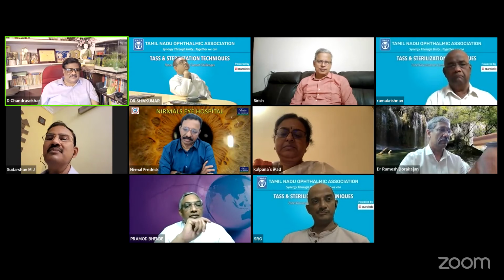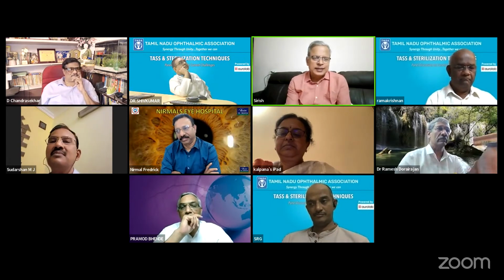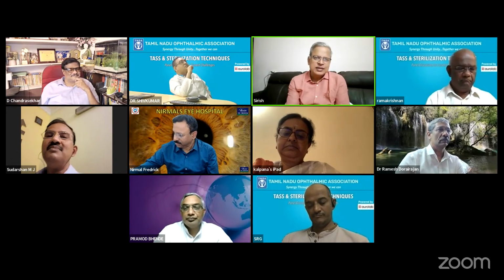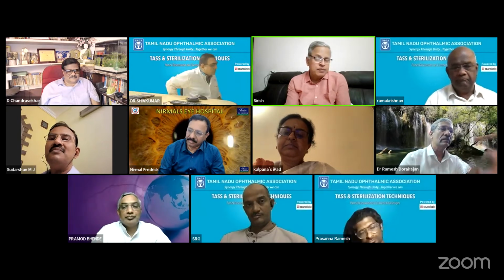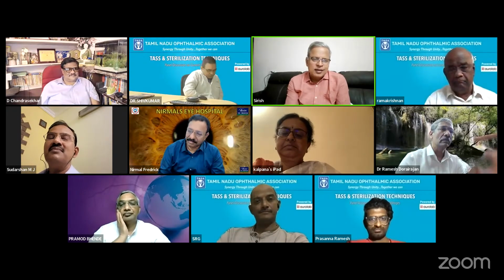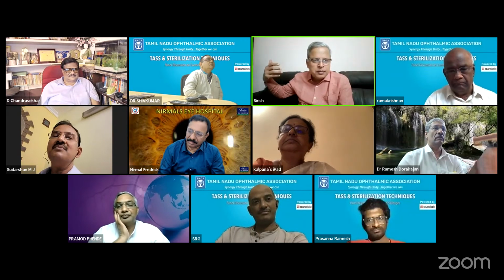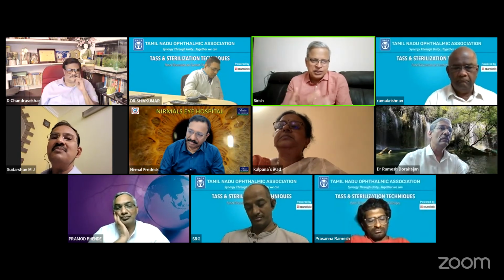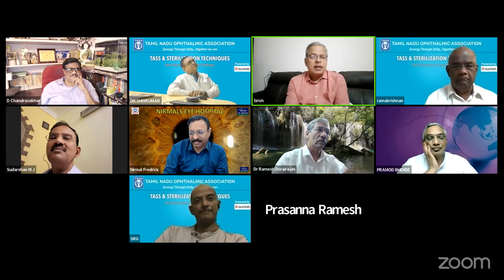Thank you. Dr. Sirish, sir? Because many of my colleagues have spoken about reusable tubings as well as reusable cannulated instruments. See, all these instruments, we only aspirate and we don't push anything inside. I'm speaking purely from logic and pragmatism. Even the reusable cassettes, the residues could be only in the aspiration line far behind, not near the eye. So if you only aspirate and do not reflux or push it forward, then nothing should normally happen. So I have never faced it, but that doesn't mean that it does not exist.